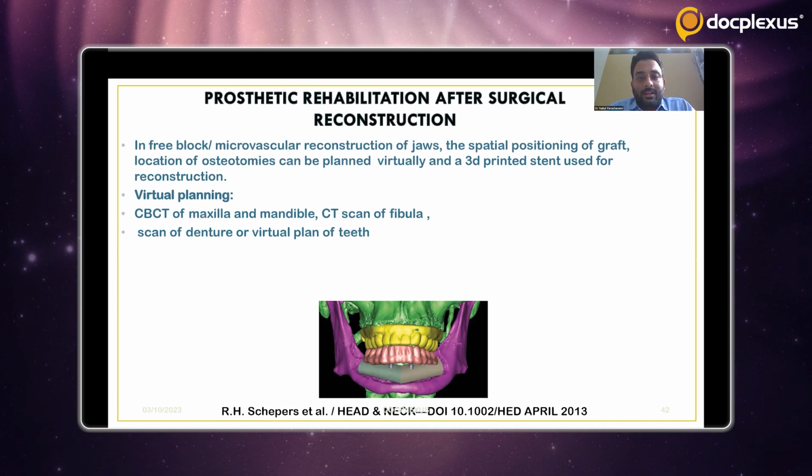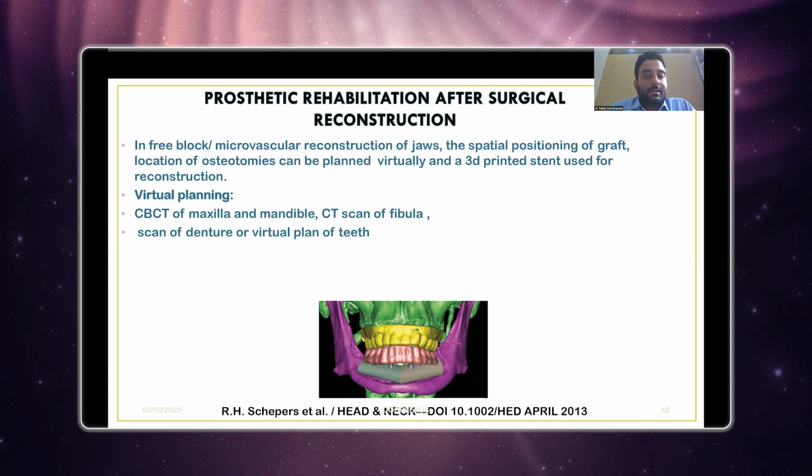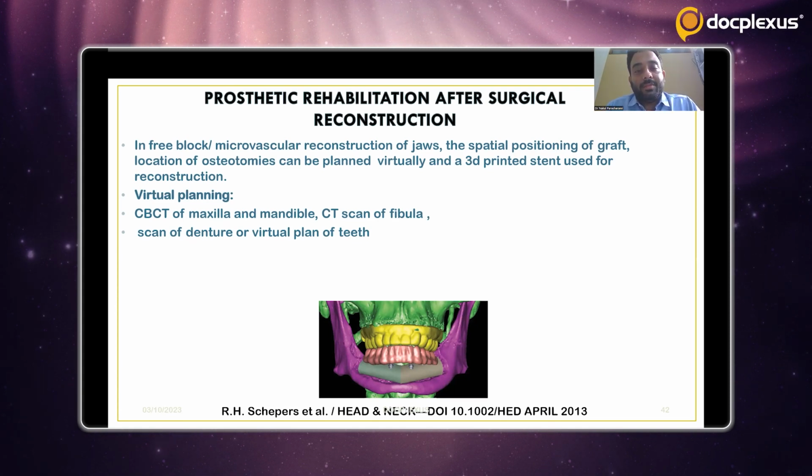So this is another excellent article in which the microvascular reconstructed jaws, the spatial planning was done using this 3D printing technology, virtual planning, along with giving a set of teeth immediately, along with the reconstruction of mandible. So it was an end-to-end surgical procedure, which is just fascinating.